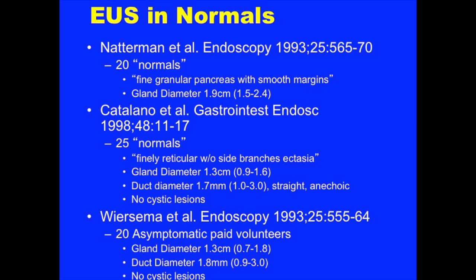We use 3, 2, and 1, for example, versus ERCP. We don't tend to have cysts in the normal pancreas, and we don't usually have stones.